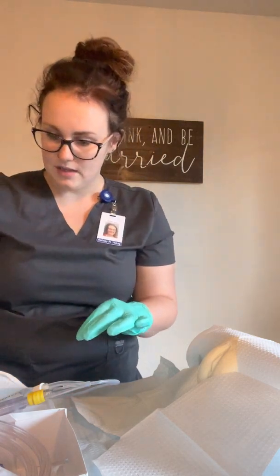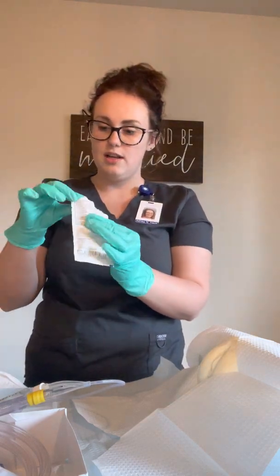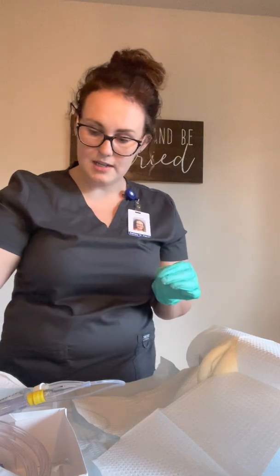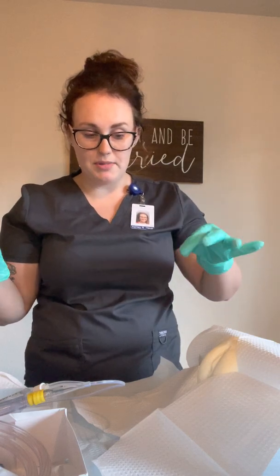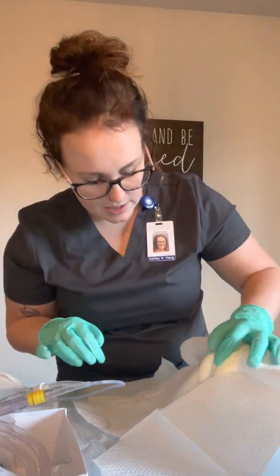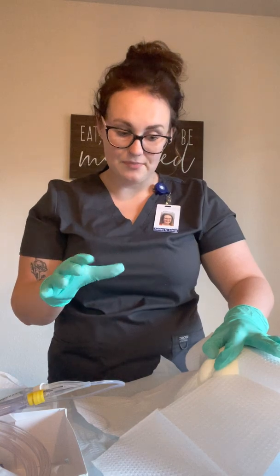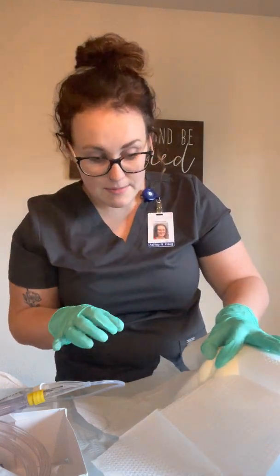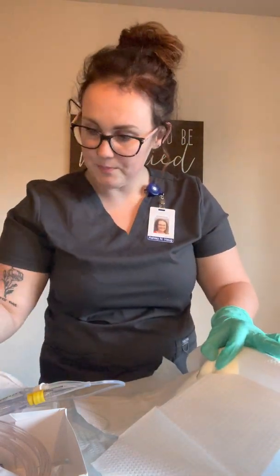Okay, so now that I've got everything in place, I am going to clean the patient with the swabs. So I'm going to go ahead and use my non-dominant hand to open up the meatus and figure out the site that I'm going to be using. Sorry, open up her labia so that I can view the meatus and I know which area I'm inserting. Okay, so I've opened that up here.